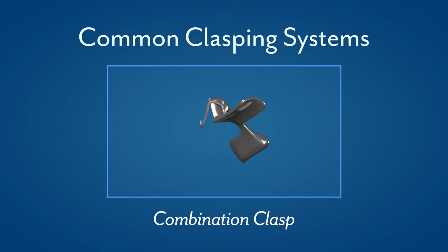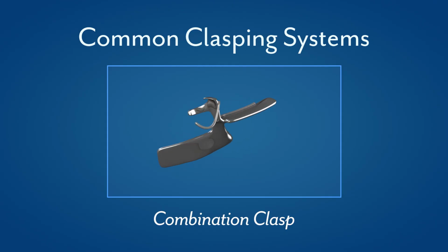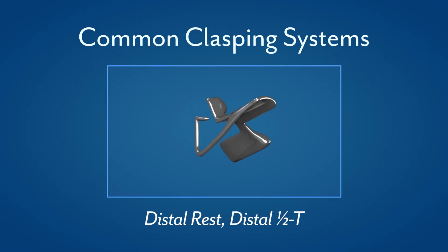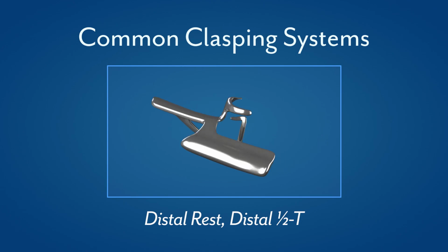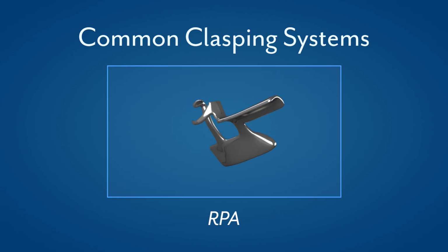Combination clasp, distal rest, distal half-T assemblies, and RPA clasping systems.